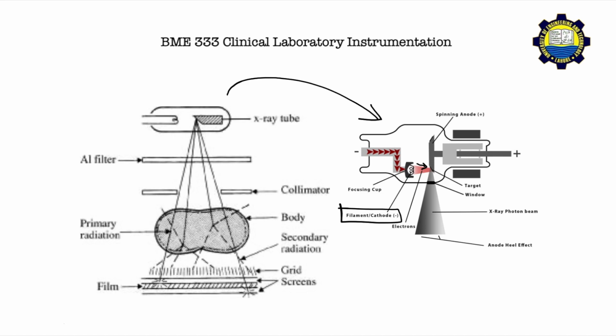Another important aspect is that this chamber is filled with vacuum. Actually, air has been sucked out, so it's not filled with anything, it's vacuum. And that is important because you want to remove any obstructions in the path of the electrons hitting the anode. So there could be electrons or nuclei from the air molecules, such as nitrogen, oxygen, even carbon dioxide.